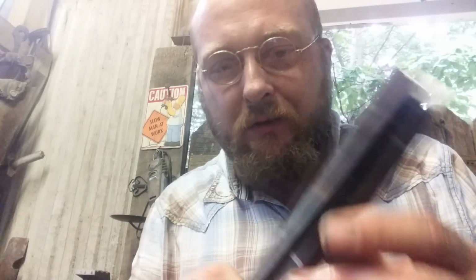Hi, it's James here from the Sprinkle Donut Forge in Moscow, Texas, and I've been working on the prosthetic hand, mechanical grabbing device rather. And if you watch my last video, you see me forging out all these pieces and putting holes in them.